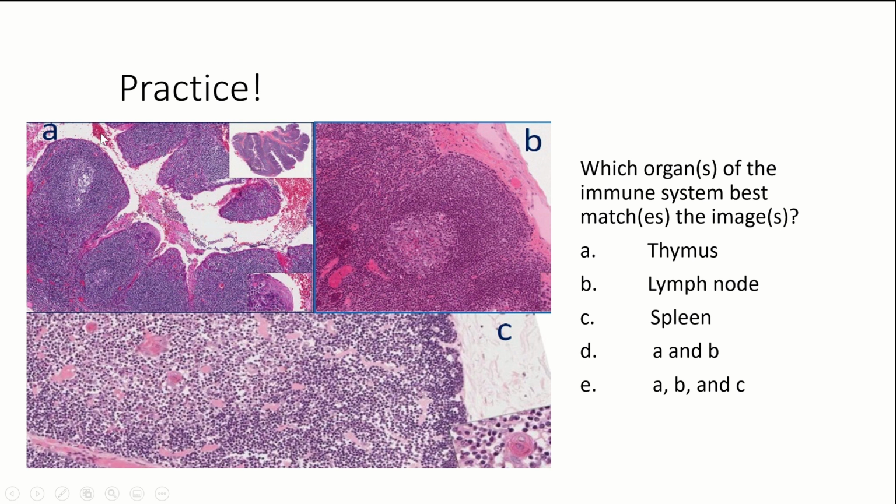Yeah, it doesn't really look the same as what I'd consider a thymus. This is actually the tonsil. Remember, we looked at it really briefly. We've just got these tiny little concentrations of lymphoid tissue, but it's not the same as the thymus where we have a medulla and a cortex and all of that, and it's all lobulated in one big kind of jumble. So this is not the thymus.